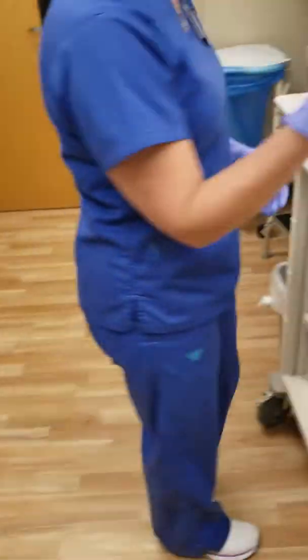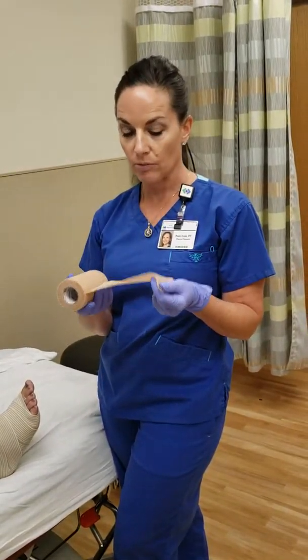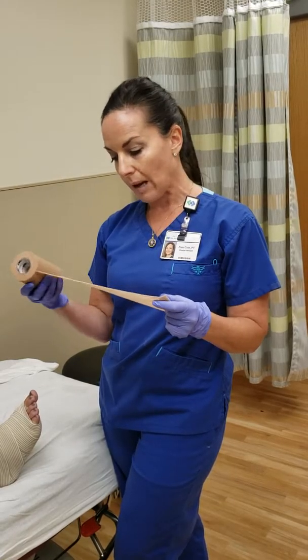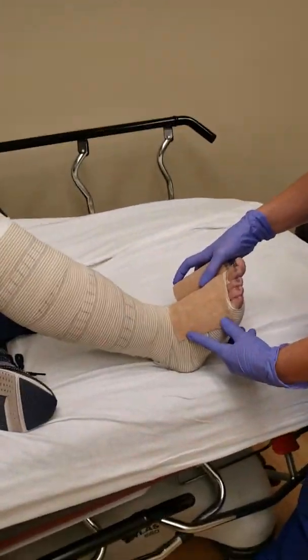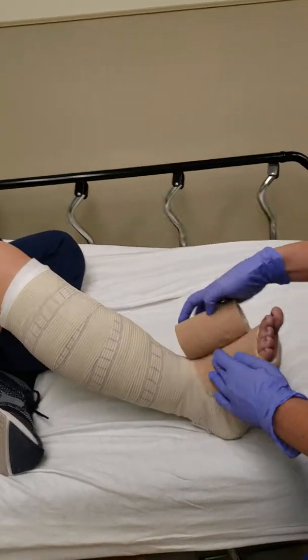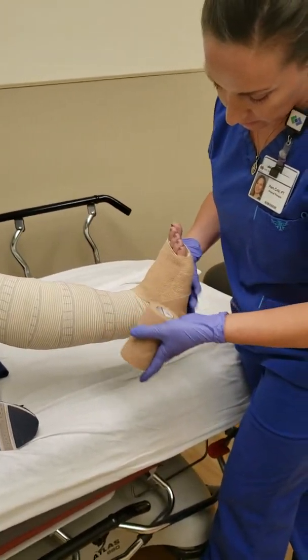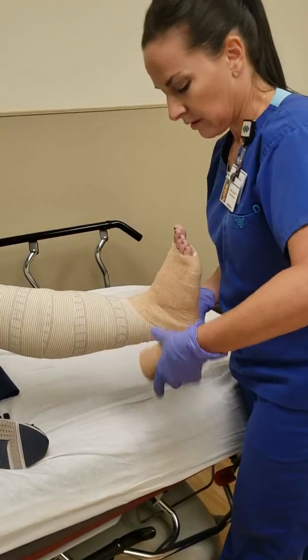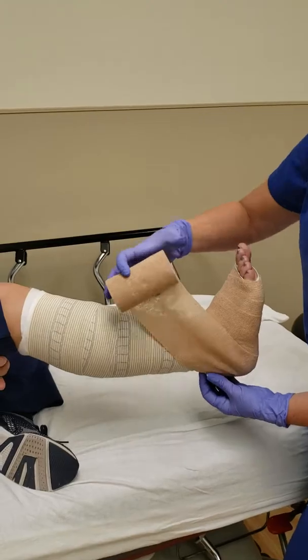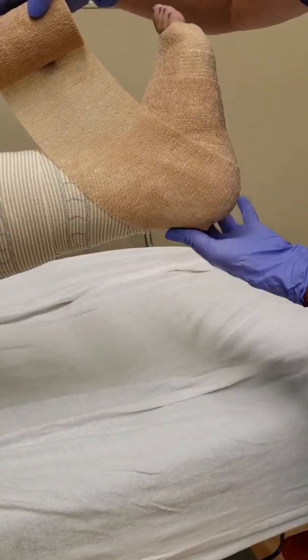Now we're going to do the co-band layer. This also builds the wall; it has a lot of stretch and is the layer that people tend to over-wrap or wrap too tightly. The idea is to unwrap it, relax it, then roll it onto the leg. Starting again down at the metatarsal heads, I take it off the roll and relax it. I'll play with the angles. You don't want any windows. Here it's a bit hard to manage, so I go ahead and pull on it, pleat it, and fold it over.